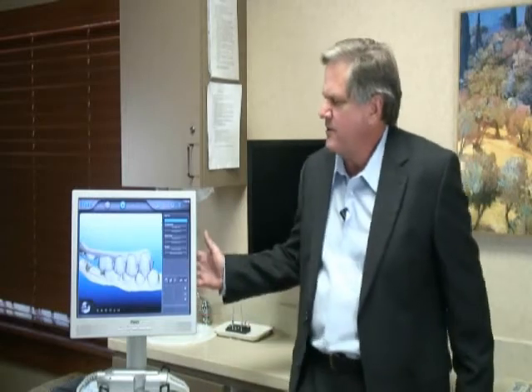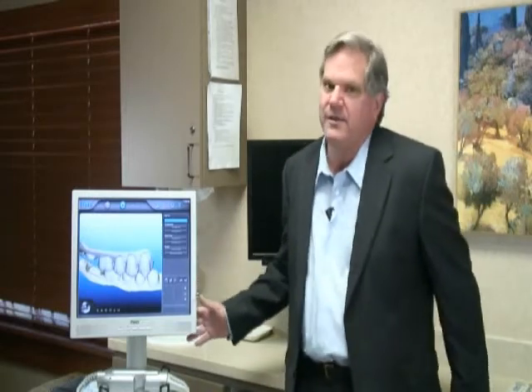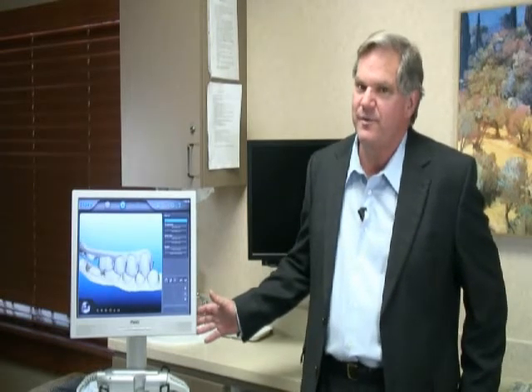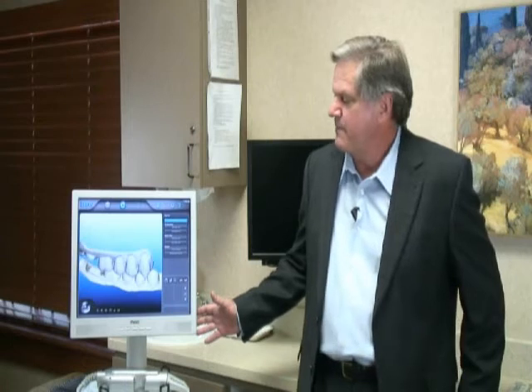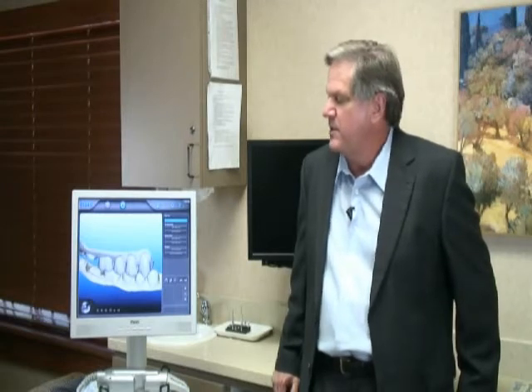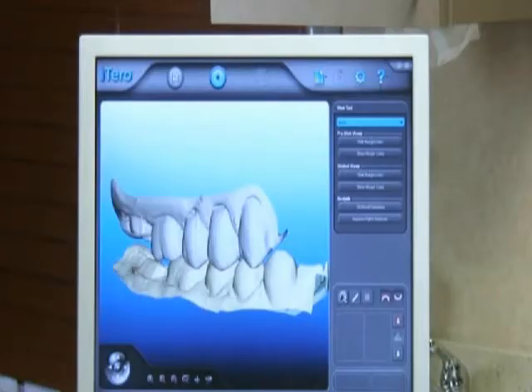iTero is to my right here. iTero literally takes us to the next level in restorative work, in terms of we can now take an impression with a camera instead of a silicon-based putty material that is inserted into your mouth in a tray and held for five minutes. And that's pretty cool.